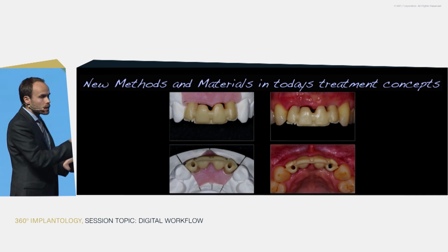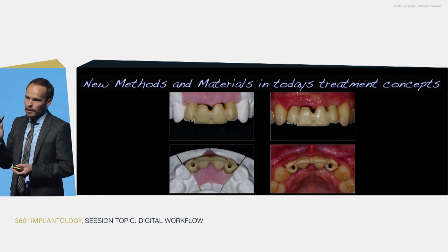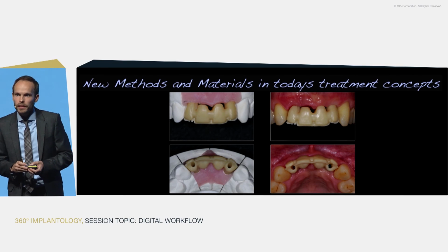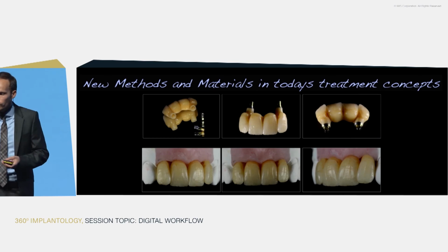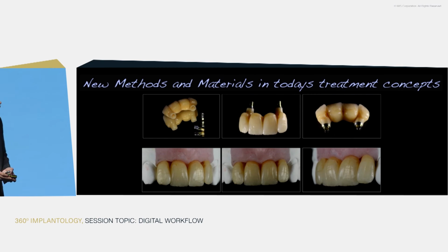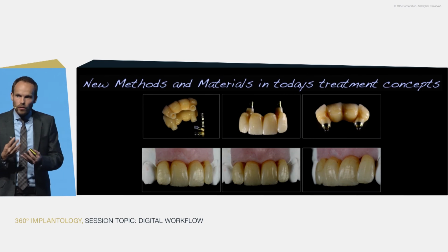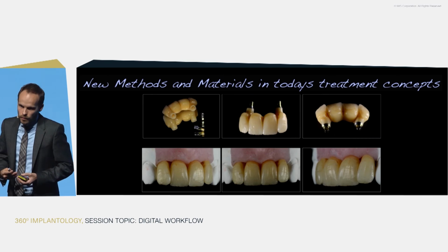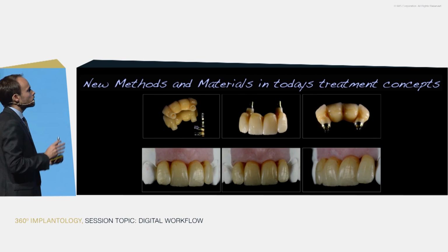But for the buccal aspect, we want to have a minimal invasive layering technique, in order to have beautiful approximal areas and a beautiful surface texture, as you can see here, and that you also saw in many of the other lectures. Creating this in a monolithic way is very difficult, and playing with the lights, like you can see here on the other cases, is much easier if you apply the ceramic.